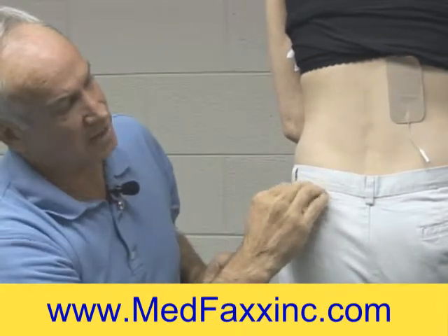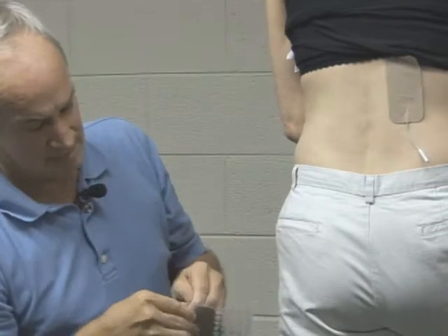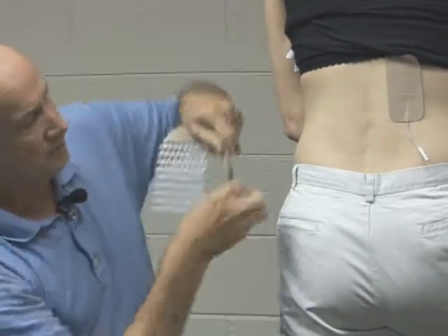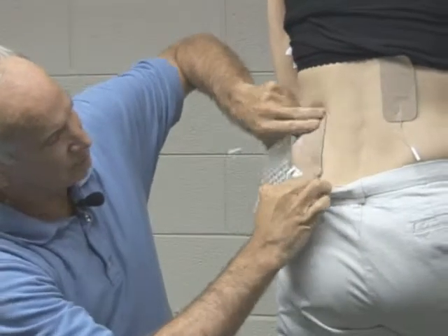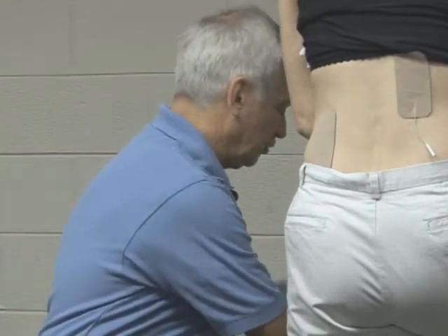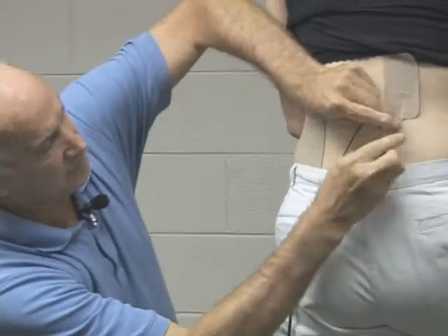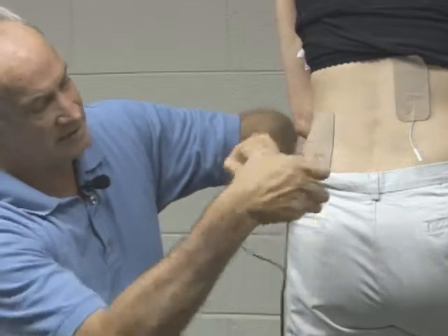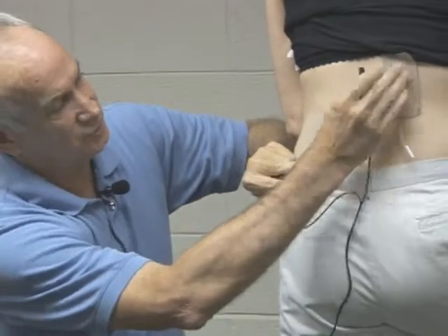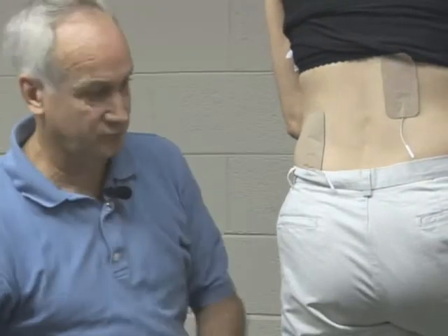I'm going to say the top right area is where she's hurting, so I place one electrode there. Then I go to the bottom left and put the other electrode down there, out to where the pain is being felt. When I plug my unit in with my two cables, I plug one into here and the other one in there. Because it's the same channel, the electricity comes out of one and goes to the other, so all the nerves in that area — the nerves we're after — are going to be affected.